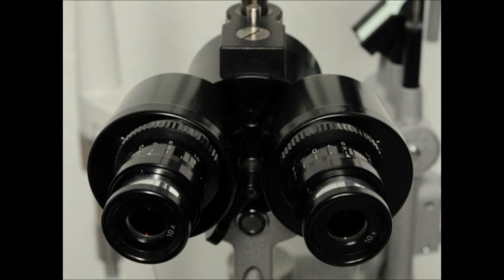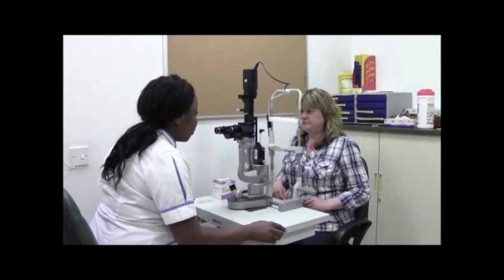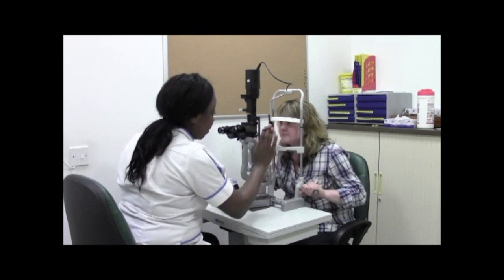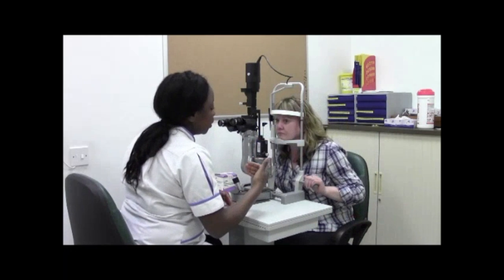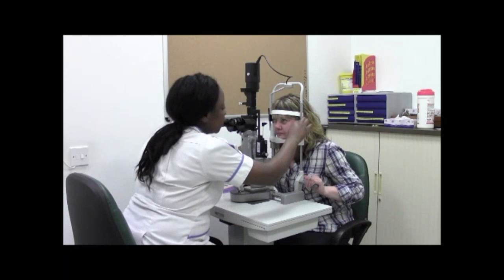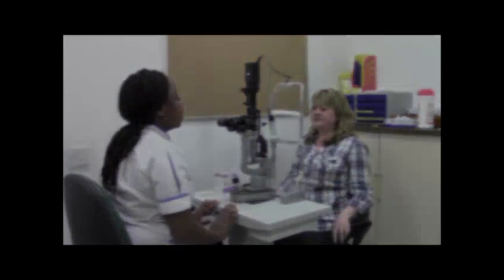Ensure that the eyepiece is set to your own prescription. Place the slit lamp height in proportion to the patient's sitting position and head position by using the lever under the slit lamp table and adjust to the required position. Ask the patient to come towards the slit lamp with their chin sitting on the rest and their head firmly against the head bar. Ensure the patient's eyes are in line with the black alignment marker, as this is important for a precise examination.